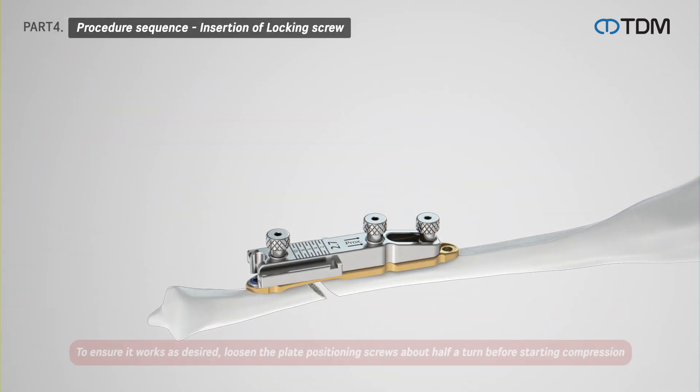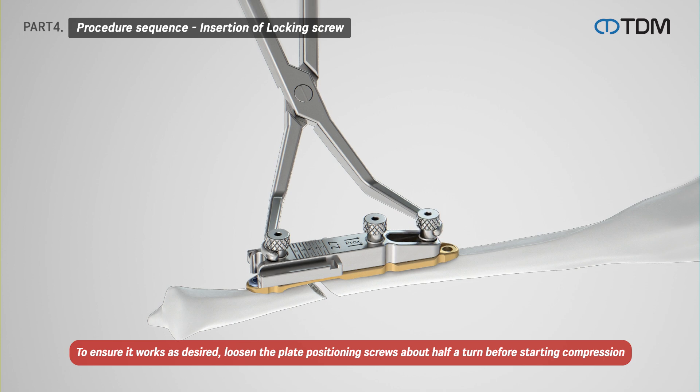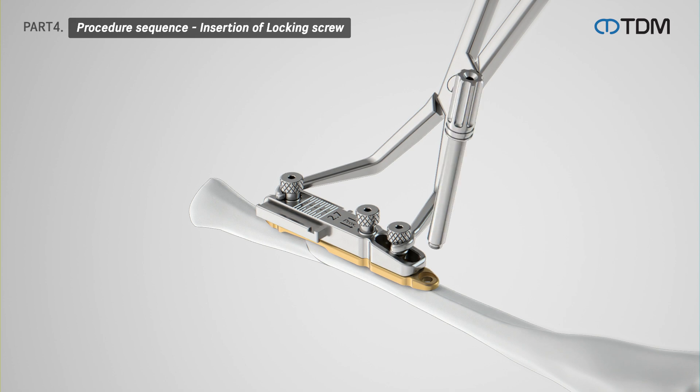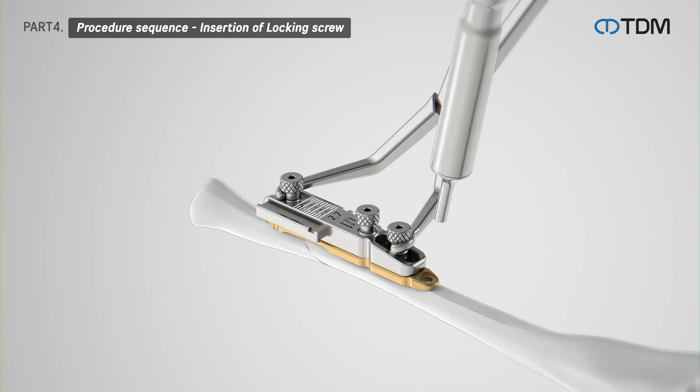Use compression forceps to compress and fix the locking screws and plate positioning screws. Attach the locking drill sleeve to the proximal hole and drill using the drill bit. After drilling, measure the length using a depth gauge, then insert screws into the locking holes.